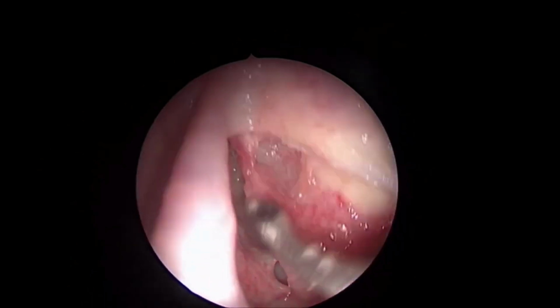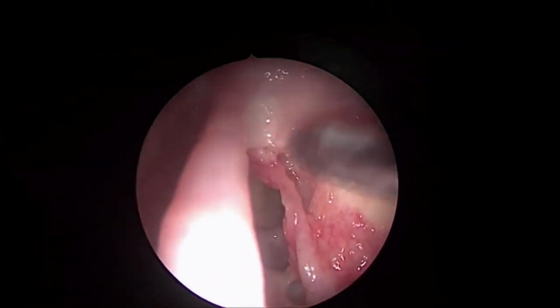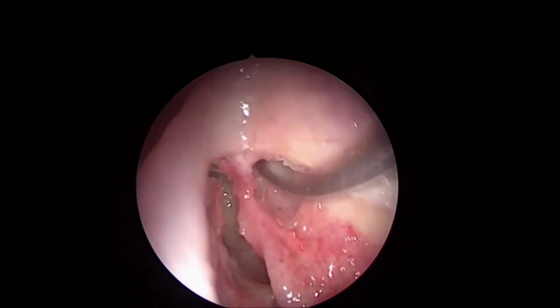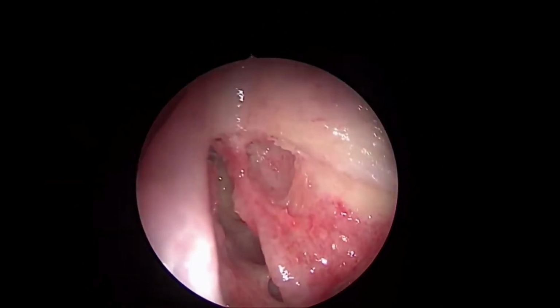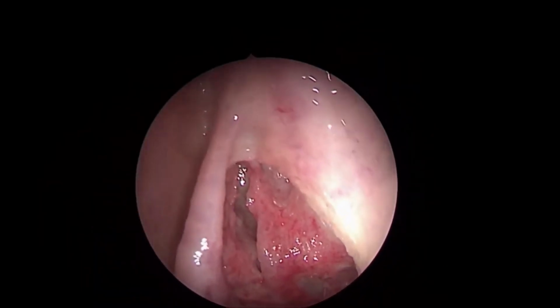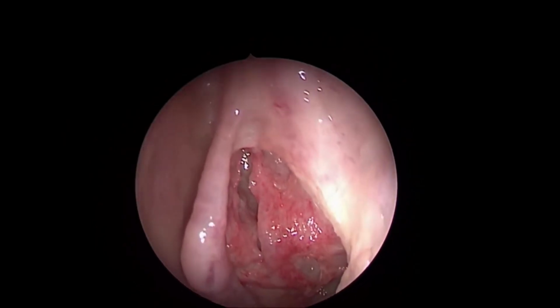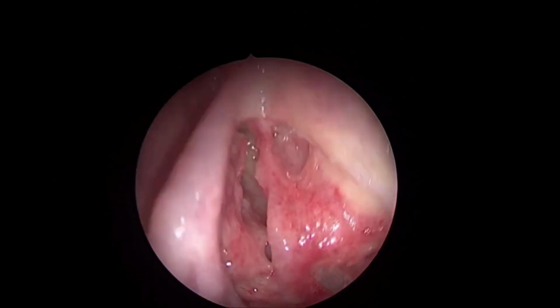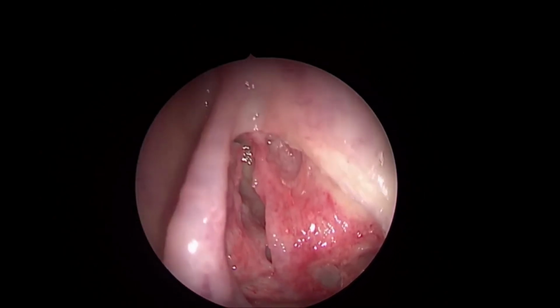What is this? Agger nasi. So there are certain cells which are lying anterior to the frontal drainage pathway, and for them the simplest is agger nasi. If there is more pneumatization of the frontal bone, this is frontal bone above, more pneumatization of the frontal bone above, which is described by Kuhn's classification, type 1, 2, 3, showing the degree of difficulty which these frontal cells can pose to the surgeon. Type 1, one cell above it, you can go behind that cell and come out. Type 2 is one more cell above it, or tier of cells above it, you have to go all the way above them to get them out.